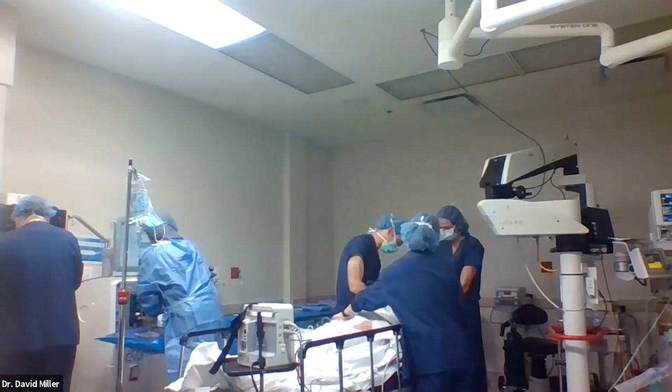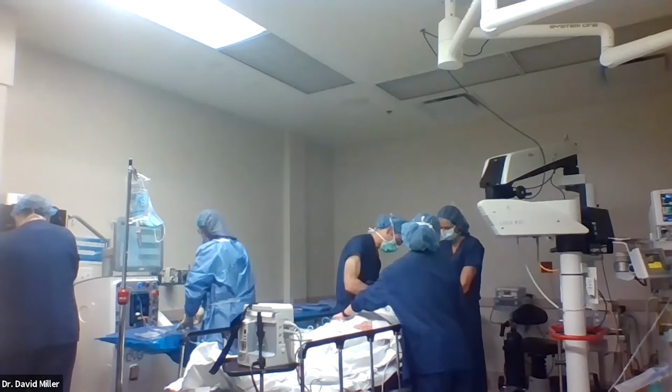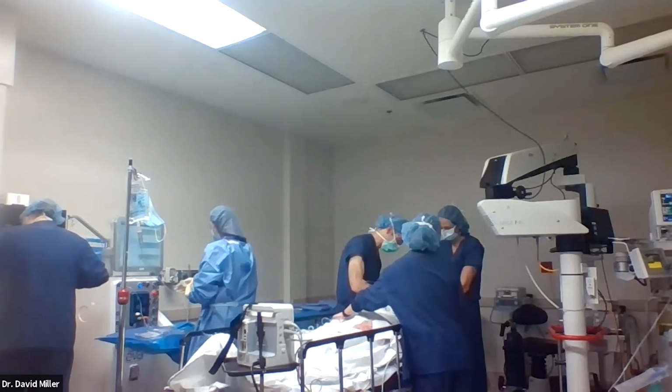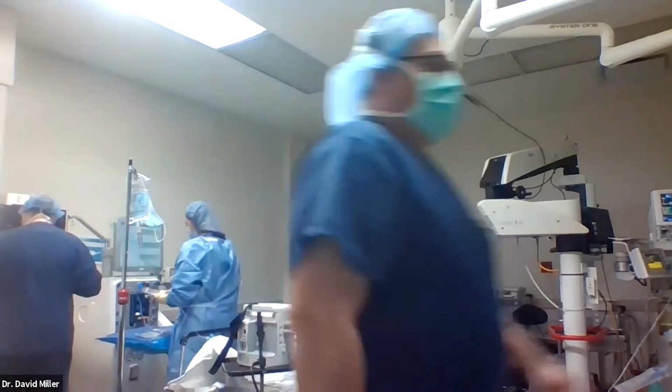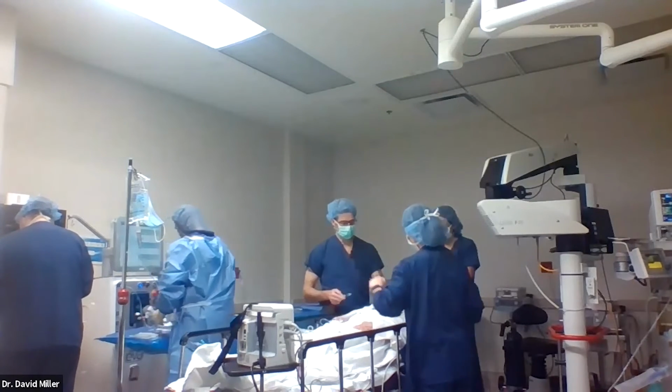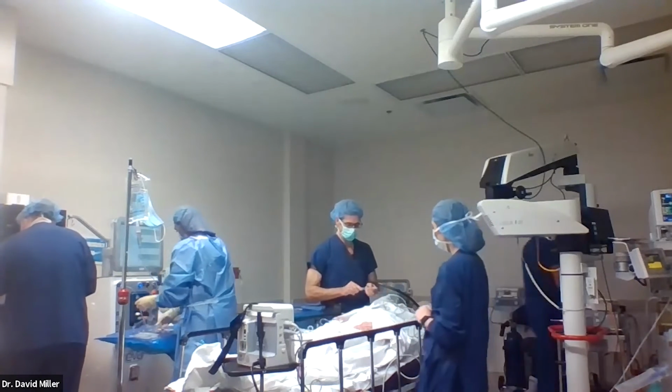Kind of give the needle a little shake to make sure we're not engaging the globe. Check for any blood return. Then I inject about 5 cc's of this, is it 2% lidocaine? 4%? 2% lidocaine? And 0.75 Marcaine. So we got some Marcaine and lidocaine.